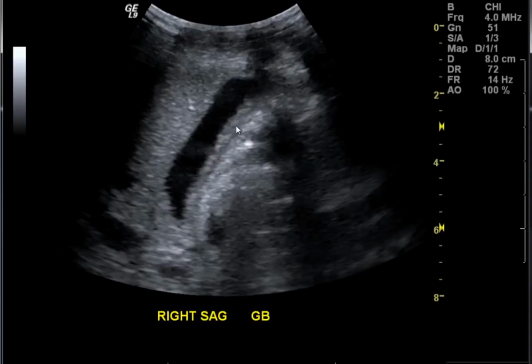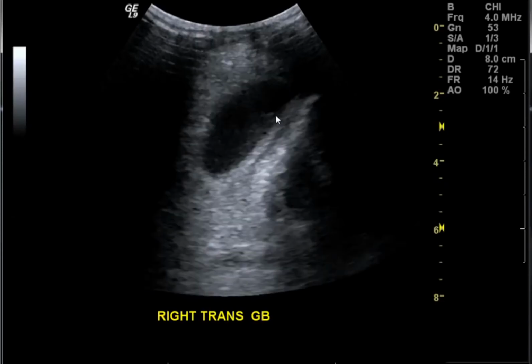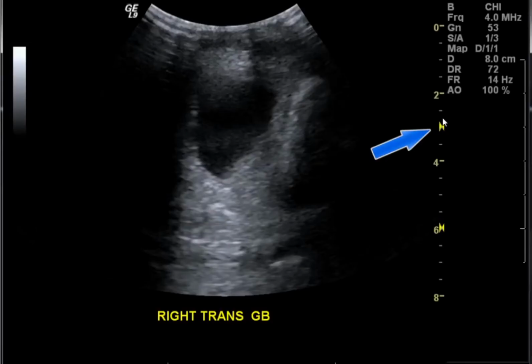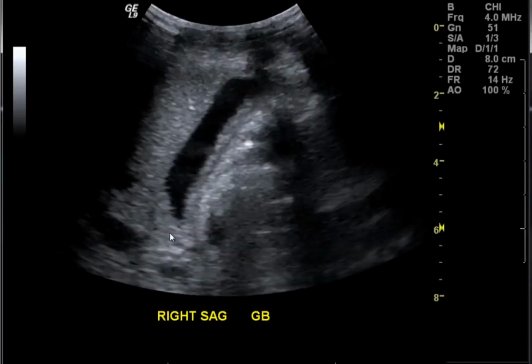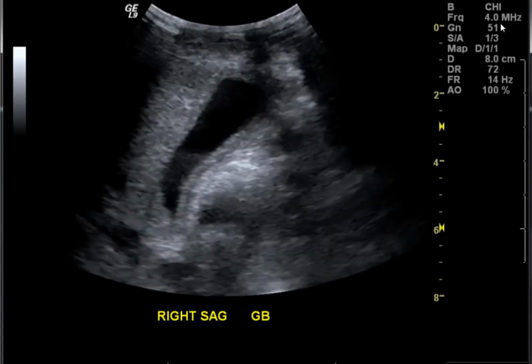One of the things to do, the techs have now used a technique to clear this haze that sometimes is within the gallbladder. You can see here they have the conventional B mode, but then they changed to harmonics. This is a method where you eliminate some of these artifacts. They're still having difficulties clearing the gallbladder completely, but here they managed to clear it, see? How did they do that? They may have dropped their gain a little bit. Let's see, they went to 51. They cleared up a little bit.